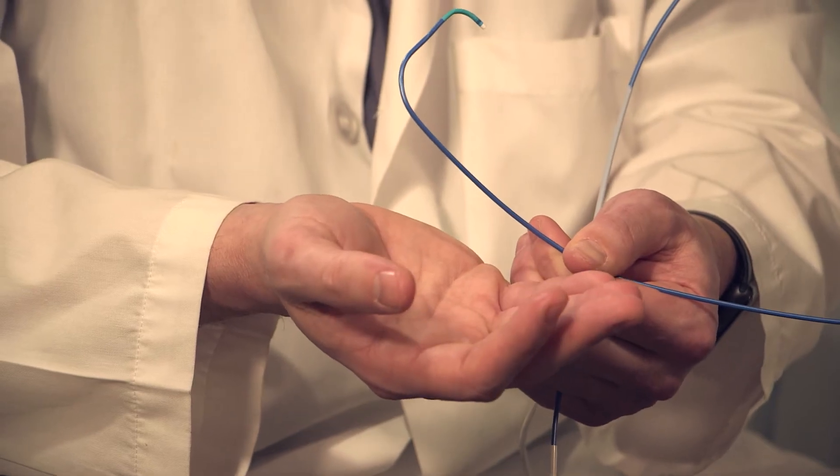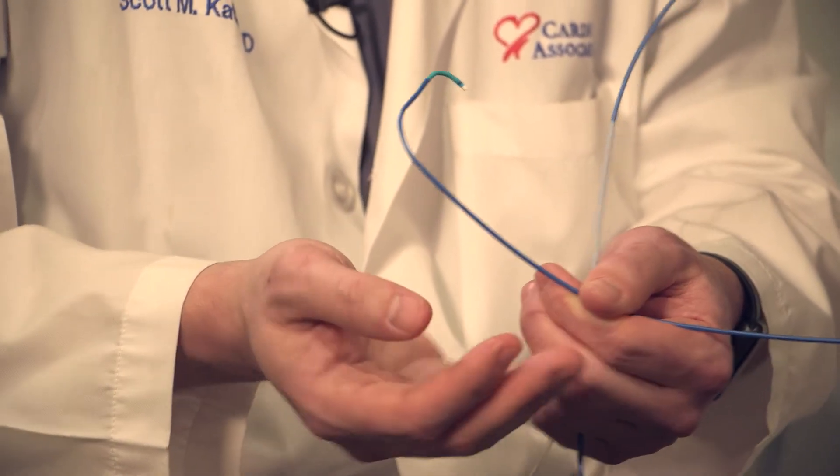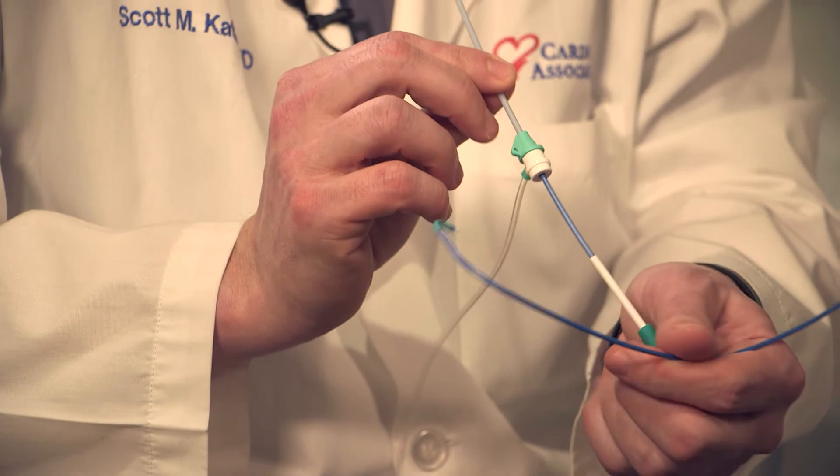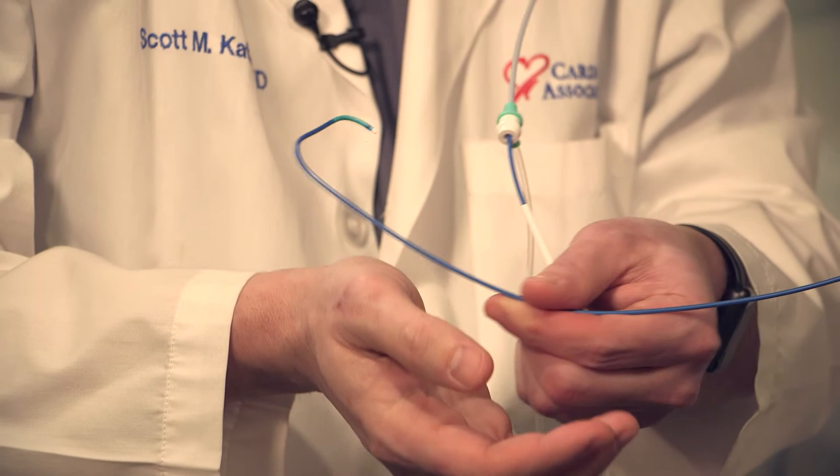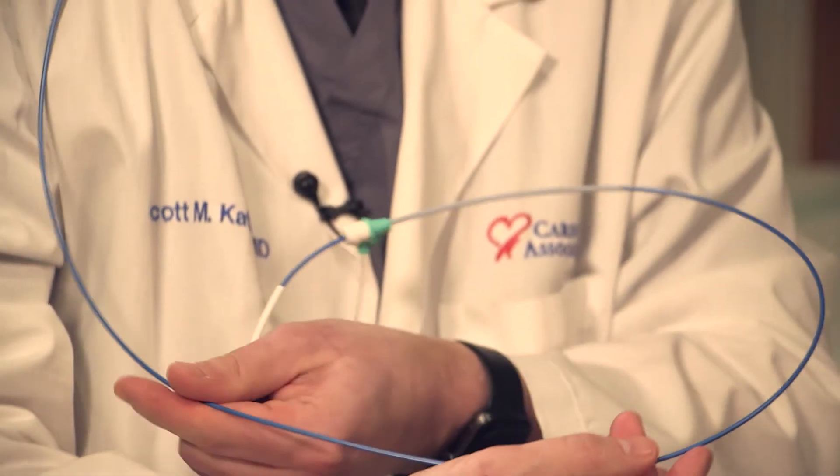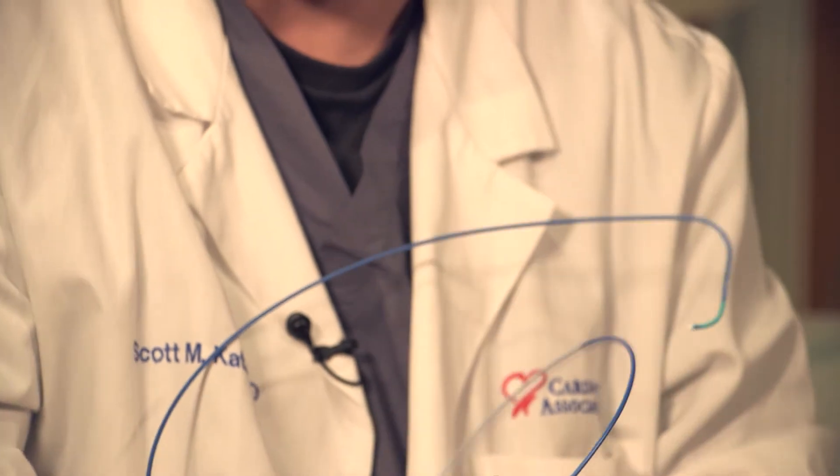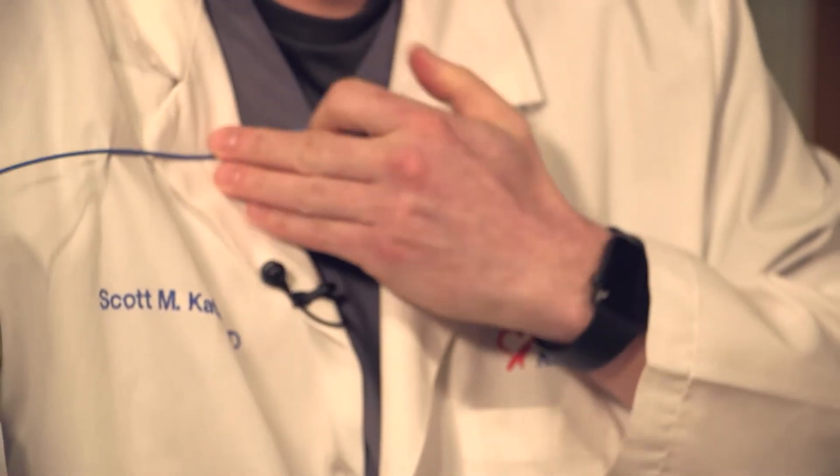Once that sheath is in, this is what a coronary catheter looks like. This will travel up the entire arm and essentially go around the shoulder and lodge right where the arteries begin to feed the heart with blood. We will inject dye through these catheters and we can see exactly where the blockage or blockages occur.